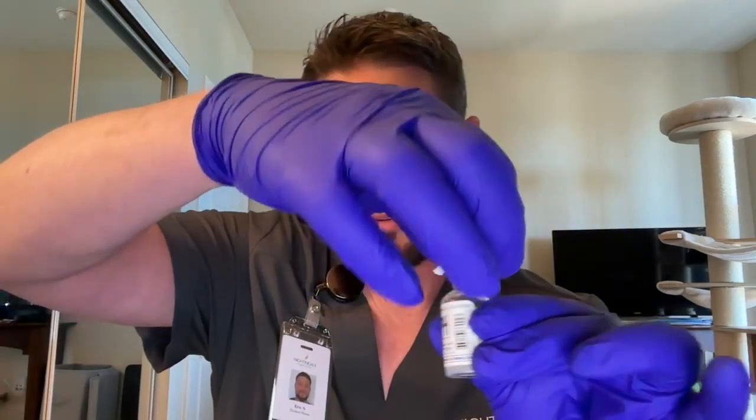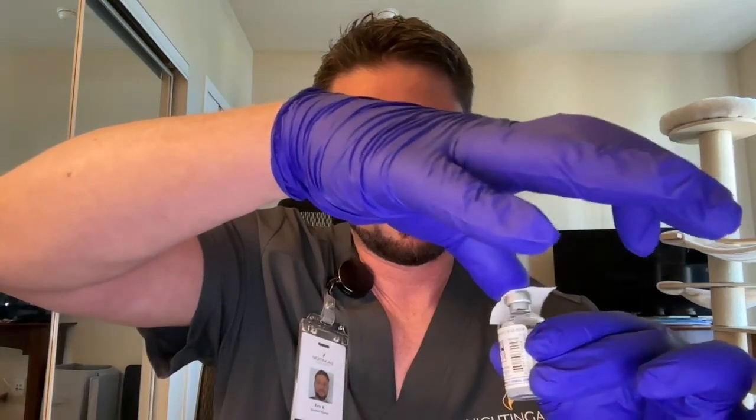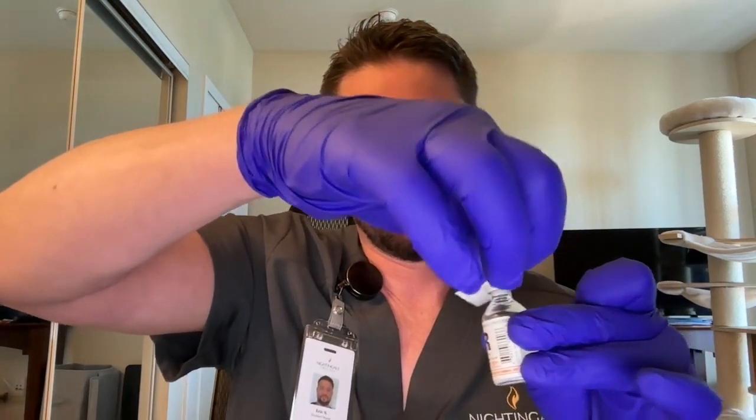So we're going to take an alcohol wipe and we're going to go ahead and thoroughly scrub the tops of the vials with alcohol. We're going to set that aside to dry. We're going to go ahead and open up a new alcohol wipe. And we're going to take our regular short-acting insulin and we're going to go ahead and thoroughly clean the top of our vial. And we're going to go ahead and set that aside. We'll go ahead and dispose of our alcohol wipe.